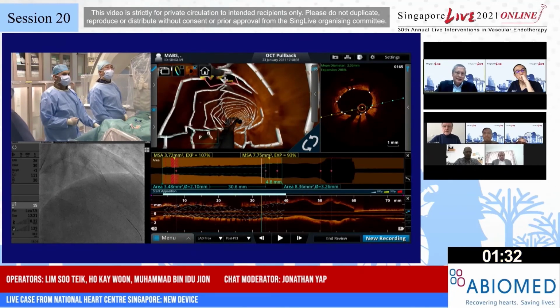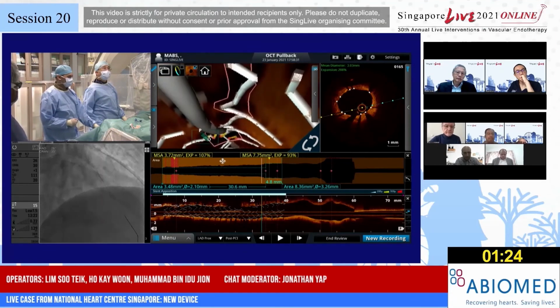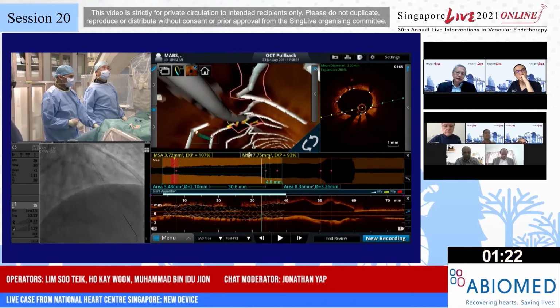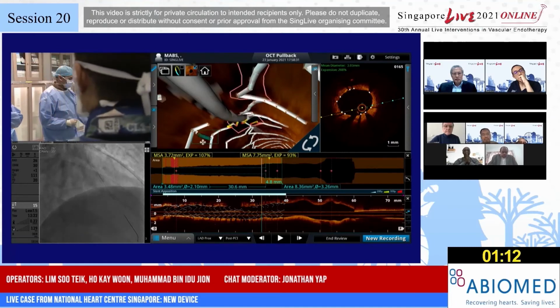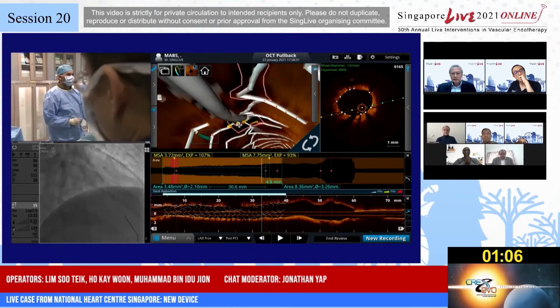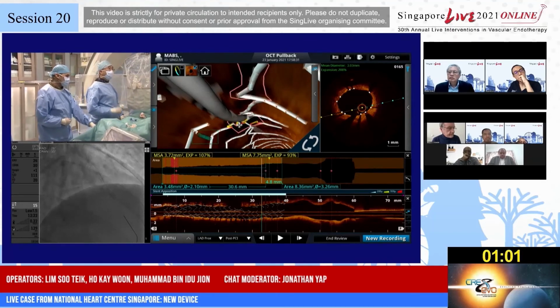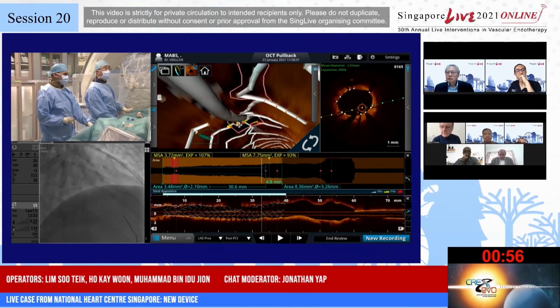When will that happen? Usually about 6 months. The novolimus will be eluted within 3 months, and then the bioresorbable polymer will get resolved after 6 months, and then the bioadapter will get uncaged, maintaining the ability for positive vessel remodeling and also improved vessel conformability to the curvature.